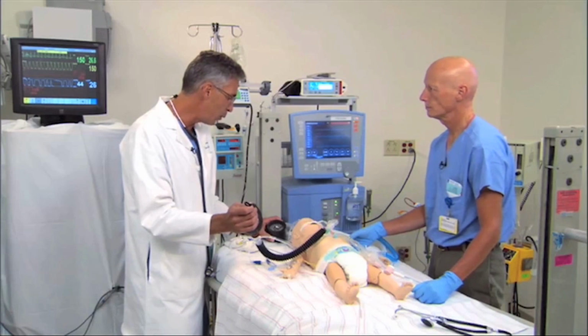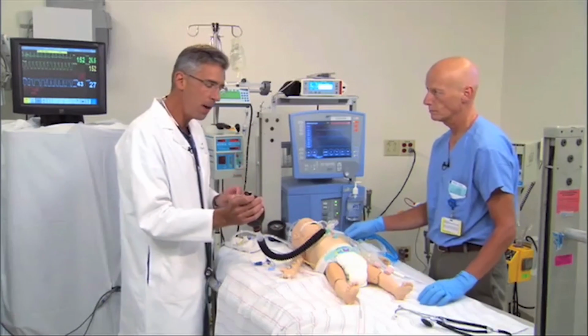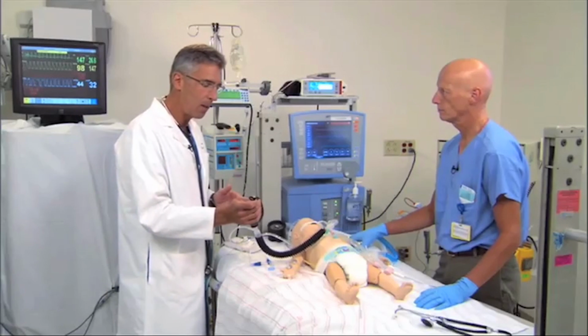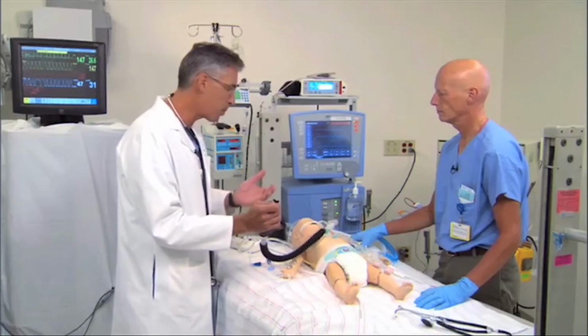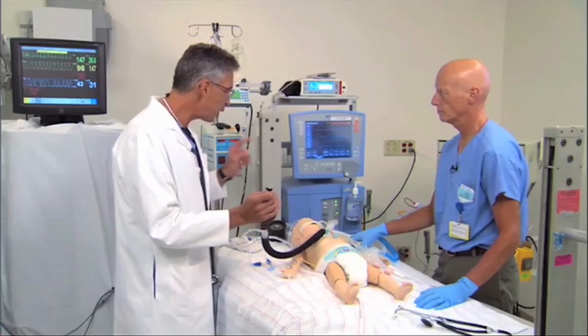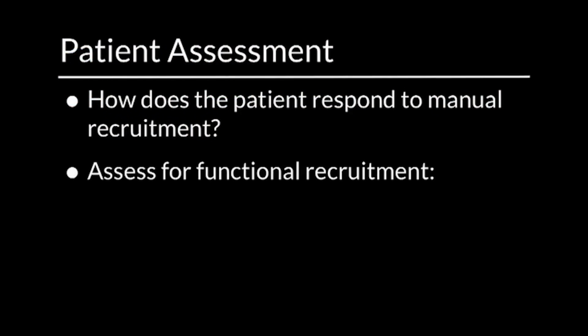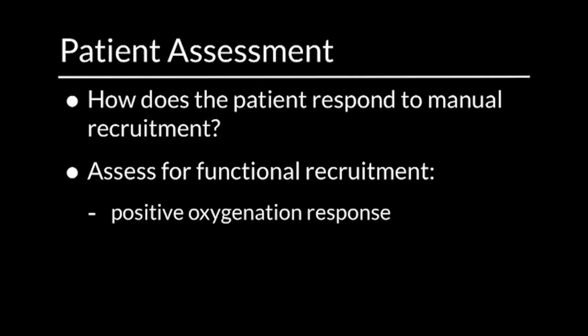And then I'm gently reopening Samantha's lungs. Now, the other important thing to assess when one is performing this maneuver is how the patient responds to manual recruitment. Now, you've probably read a lot about anatomic recruitment, measured by a CT scan or positron imaging, but we're interested here at the bedside in functional recruitment. And the way we define functional recruitment is a positive oxygenation response.